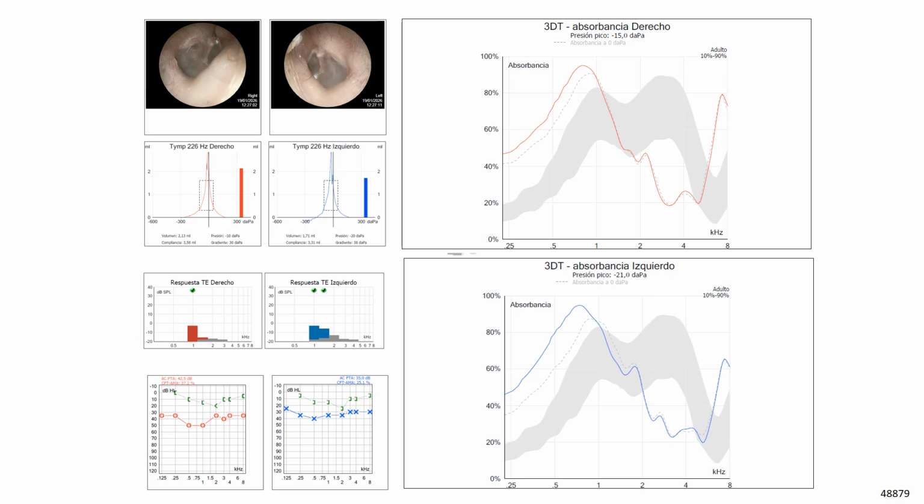However, the audiogram shows a conductive gap, with a Carhart notch at 2 kHz. This pattern usually suggests increased stiffness, like in otosclerosis, so we have a contradiction. WBA shows low stiffness, but the audiogram looks like high stiffness. This shows the value of WBA. It reveals the real problem. The ossicular chain is disconnected. This example shows why we must use all tests together to reach the correct diagnosis.